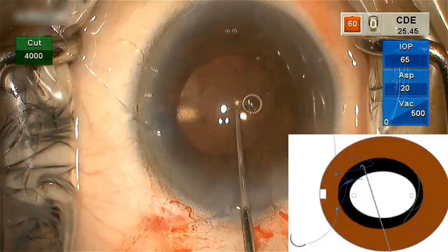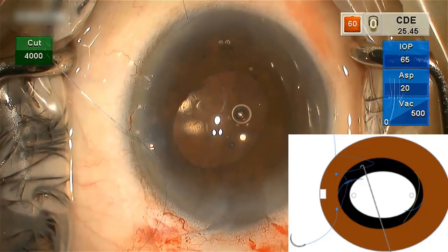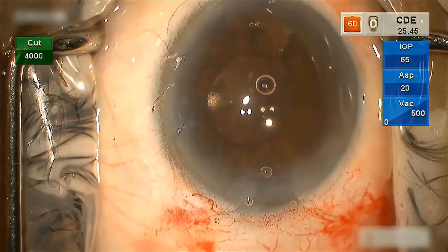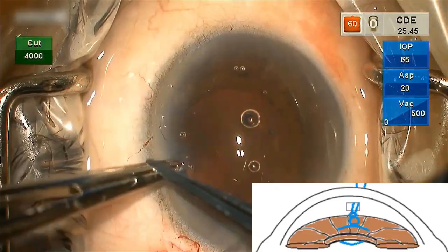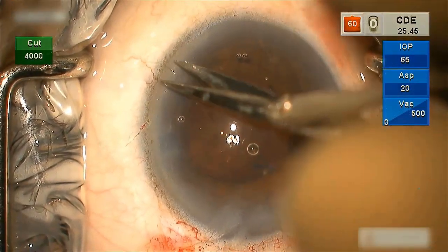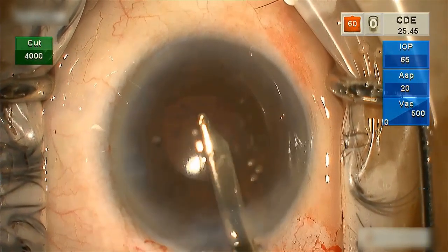The suture ends are trimmed and brought into the anterior chamber by swiping with the spatula or Sinski's hook along the iris plane from the periphery to the center. To secure the knot, both suture ends in the anterior chamber are retracted through the same paracentesis outside the eye using a Kuglen hook. The suture ends are tied together so that the knot does not crush the iris tissue and forms an arc between the two bites, not resting over the iris. Viscoelastic device is removed using controlled irrigation and aspiration.